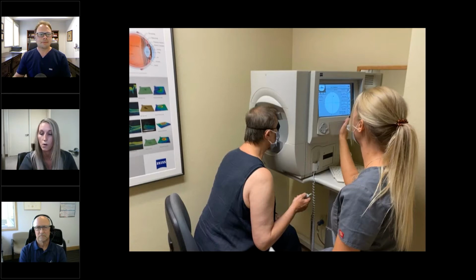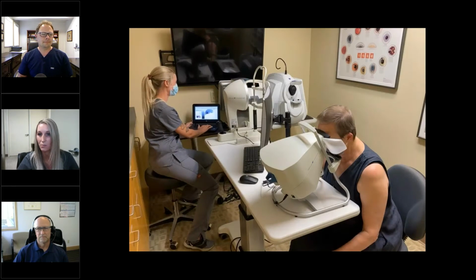And of course, the patient would grumble because the test takes so long. So the test is taking 5 to 6 minutes per eye. And if they're missing a whole bunch of them because they truly do have a defect, then they're going to be in there for about 8 to 10 minutes. Right. So with that being said, just taking the trial lens out, replacing it, having them put it on the other eye, they're tired by the end of this test and they want nothing to do with the technician. I can tell you that. And then go back to the other image, Dr. Hale, if you could please, thank you.